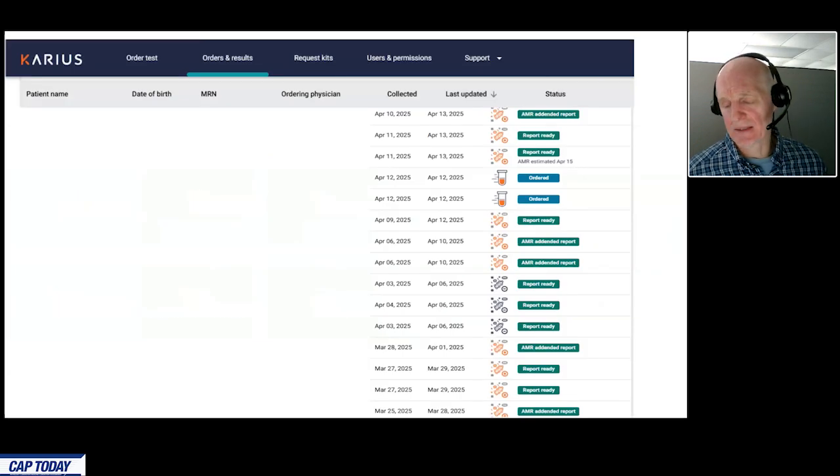I thought when I was making the slide deck last week, it might be informative just to take a couple screenshots of patients from the prior week and let you see how these results flow into the EMR. So we have a couple cases here where you can see the test was ordered, collected, centrifuged, and shipped via FedEx to the Karius lab on April 4th. Less than 48 hours later, we had a result in the EMR without any indication for addending the report with antimicrobial resistance results.